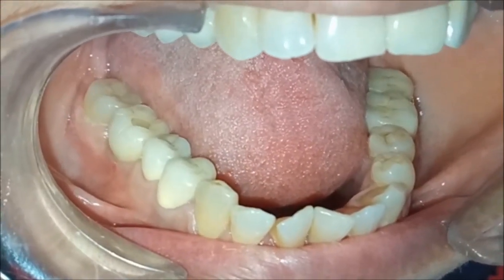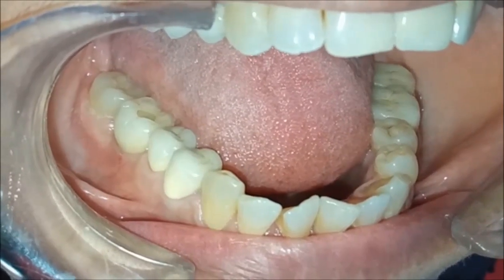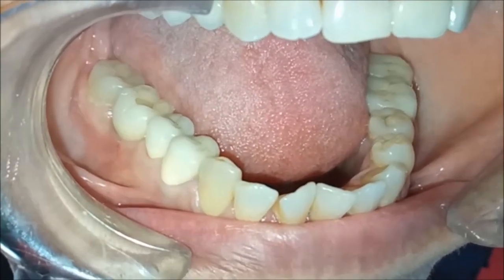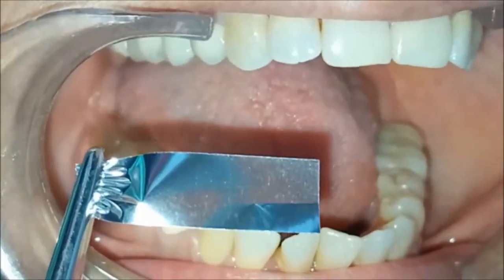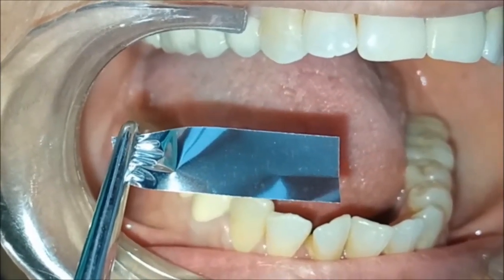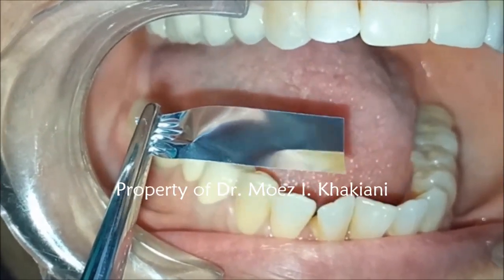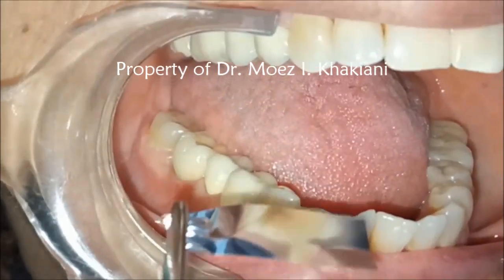We have just completed the usual adjustment for the implant crown on 4.6 and the Emax crown on 4.7. I wish to show you how to check the patency of contacts with the help of a shim stock. A shim stock is an articulating foil which is metallic in nature. It is not going to give you articulating paper marks, but by checking the tuck that it gives and the resistance on pull, it tells us whether there is a positive contact or not.